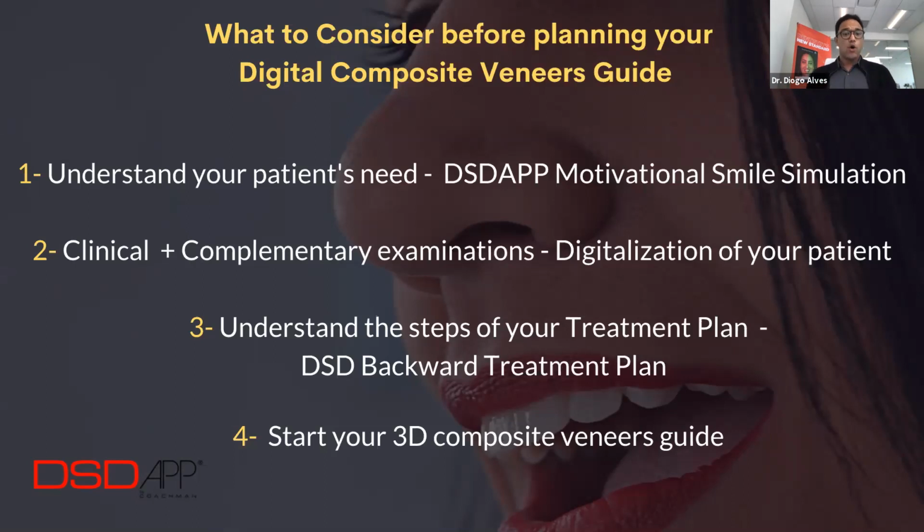And then of course, once you understand what the patient wants, once you know exactly what he or she needs and desires, you then take this patient to the clinical room so you can take the complementary examination. So you digitalize your patient. You add all of these documents such as x-rays, intraoral scans, or other photos into the app as well. And that will help you organize yourself. It will help you create this digital patient in order for you to use it as a tool for your treatment plan.